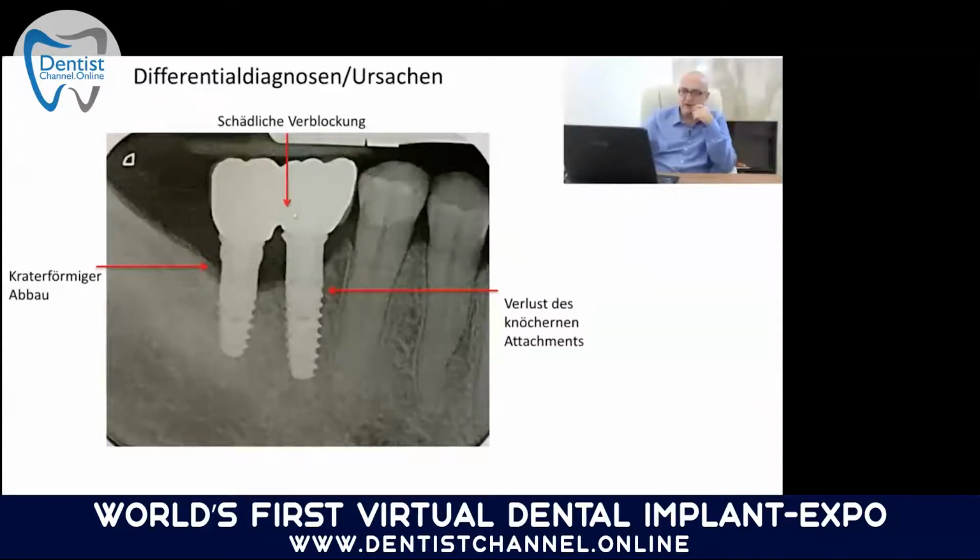The crowns are one piece, so it's a block of crowns on those two implants. This is, of course, always a very unfortunate situation, because blocking these implants takes away a lot of the elasticity of the bone, because the implants actually are stiffening the bone too much. And we know nowadays that this type of blocked crowns creates much more periimplantitis than if you keep single crowns. I mean, it could be also two single crowns on those implants.